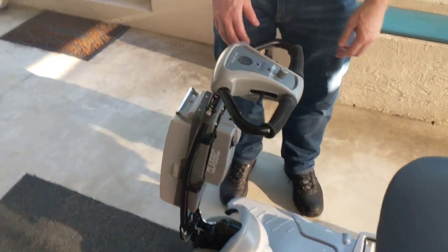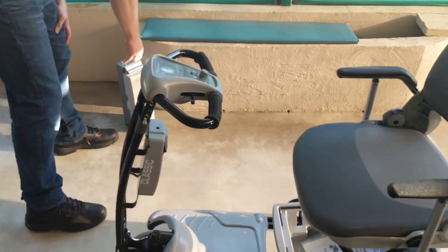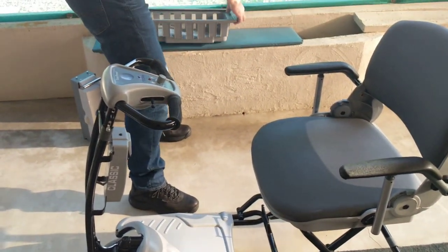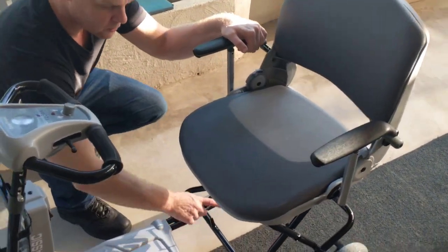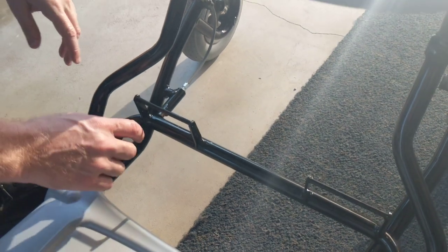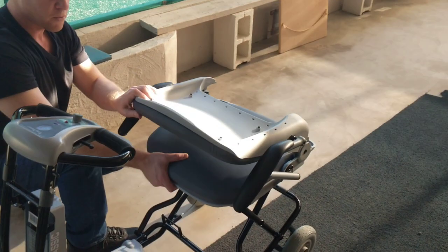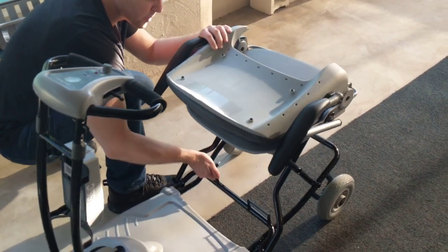To fold the scooter up, the first thing to do is remove the battery and remove the basket. Taking a look underneath the scooter, there's another lock — you can see two handles here in the locked position. To unlock this lock, you fold the back of the seat forward, which allows you to disengage the back of the scooter.